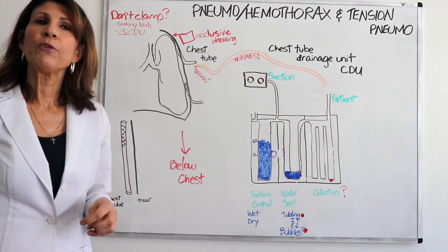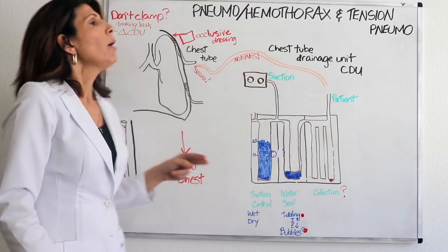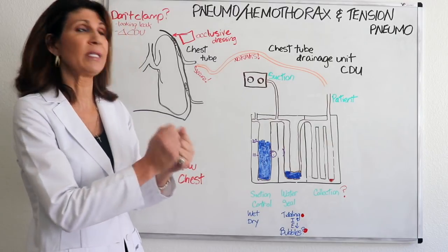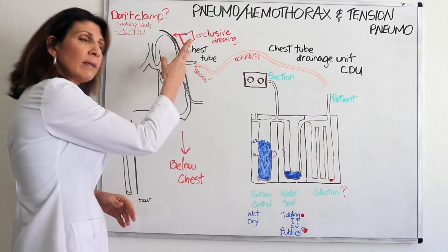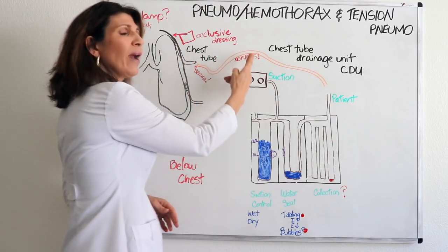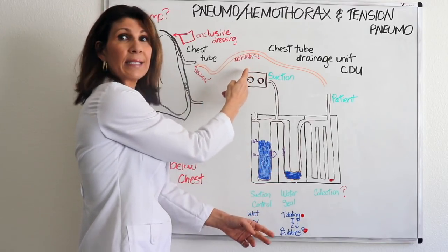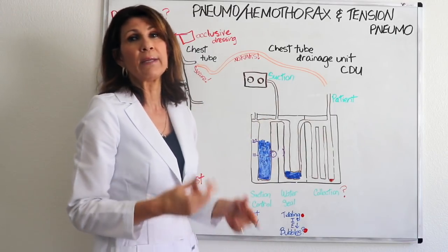Let's talk about clamping for a minute. Just as a rule, you never clamp this chest tube. However, when you have constant bubbling in this water seal chamber and you need to figure out where the leak is, so maybe you can tape it over or whatever you need to do to resolve that leak, what is done is that you clamp just momentarily to see if you can figure out where the leak is located. Because if you clamp it here and you still see it bubbling, well, it's not up that high. And as you keep going down, you can tell where the leak stops.